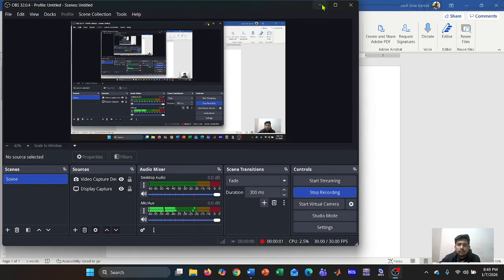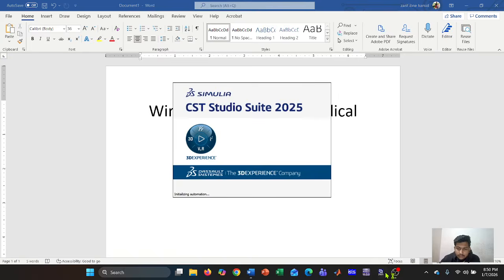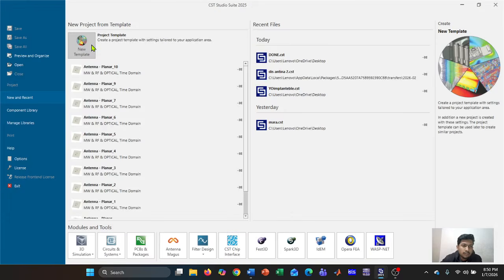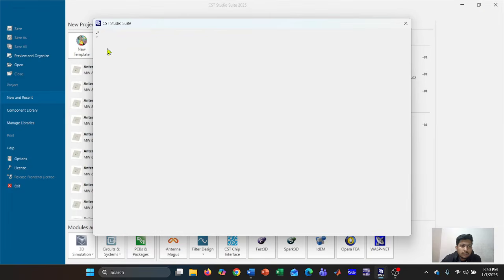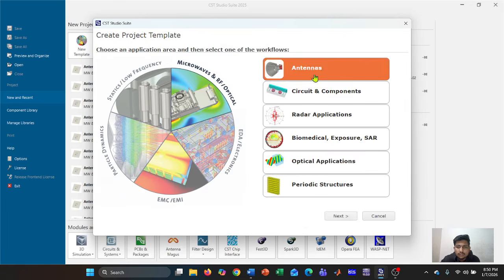Hello everyone. Today I am going to design a wireless implantable medical device antenna, which will be 5 millimeters. So I will be showing the full tutorial on how I design it. First of all, make a new template. Here you need to select microwave and RF antenna.